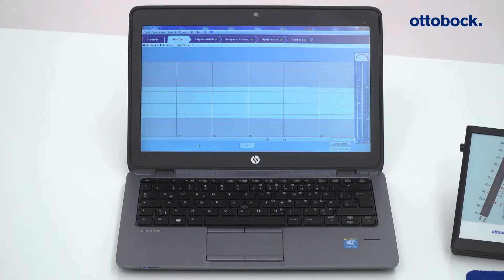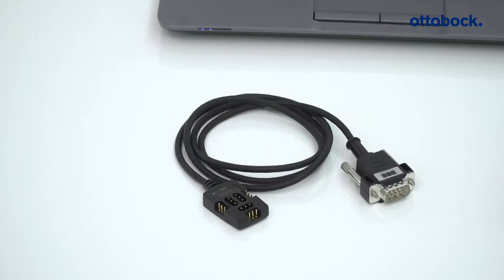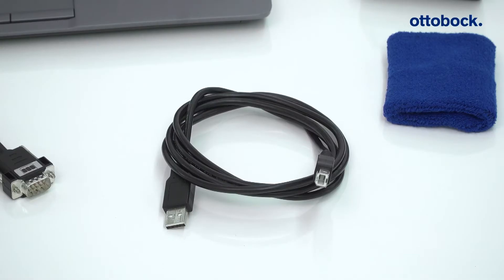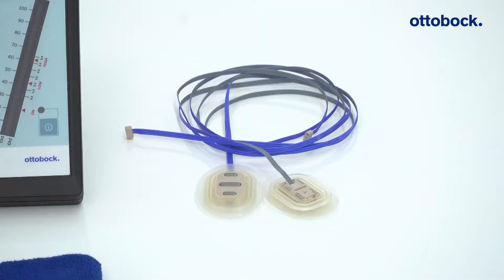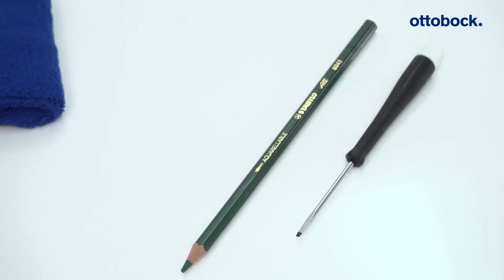A PC with installed Paula software, the exchange myoboy including electrode adapter and USB cable, two myobock electrodes, an electrode armband for placement of the electrodes on the residual limb, a small flathead screwdriver for adjusting the electrode position, and a pen to mark the electrode position on the skin.